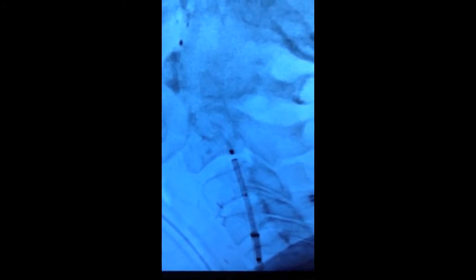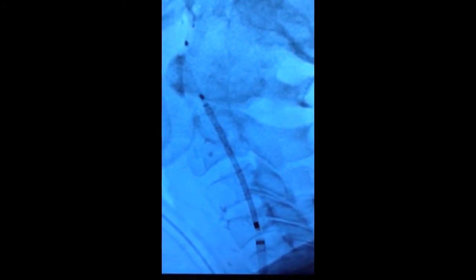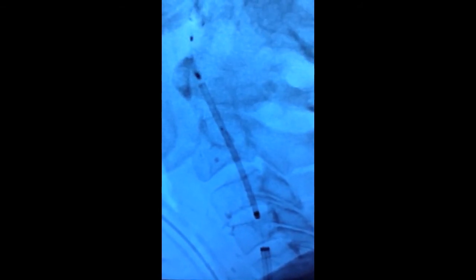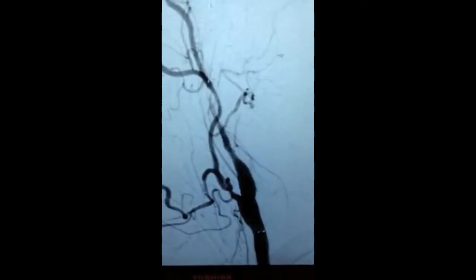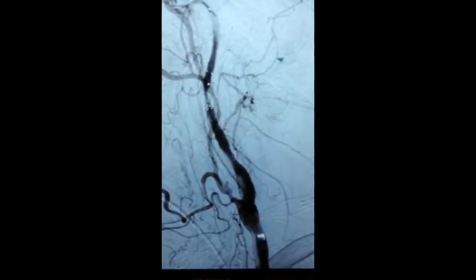A balloon has been placed to try to open up the artery. The protection device is already in position. The stent is now placed across the occluded segment of the artery and the stent is opened. We now see that the blood vessel has reopened.